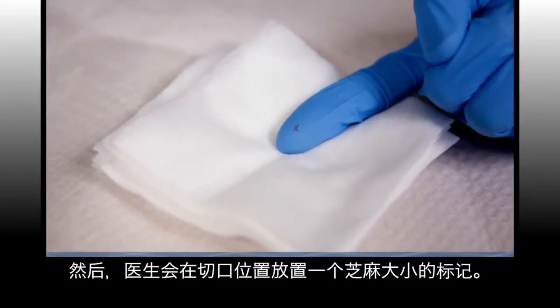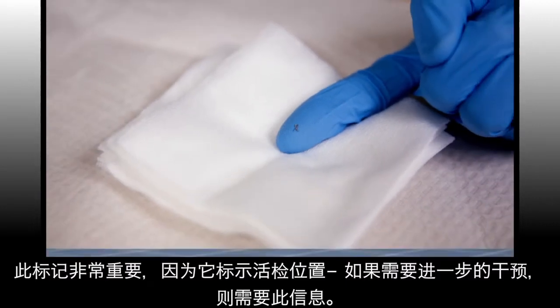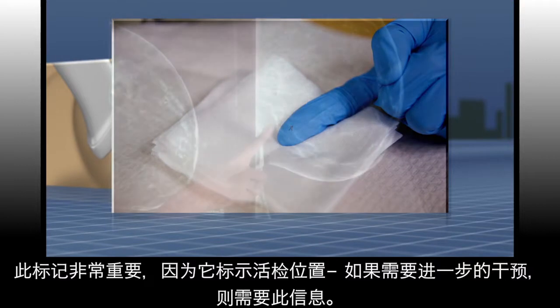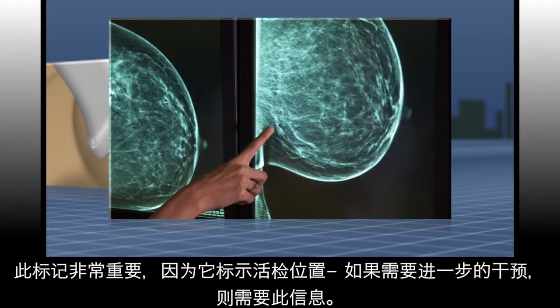Then the doctor will place a tiny marker, the size of a sesame seed, at the site. This marker is very important as it marks the location of the biopsy, information that is required if any further intervention is needed.